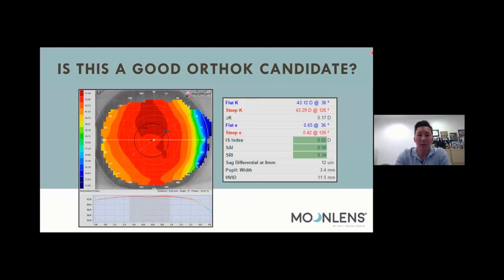Topography is very important related to the Moon Lens because you're going to use the raw data from the instrument to design a highly customized lens — a lens designed to be accurate to the micron for all of its sections. We really want good topography data to achieve the highest first-fit success that we possibly can. Let's start with a case. Here's your baseline topography. This patient came in to see you and wants to have orthokeratology done — you're going to assess this topography and decide if they're a good or bad candidate.